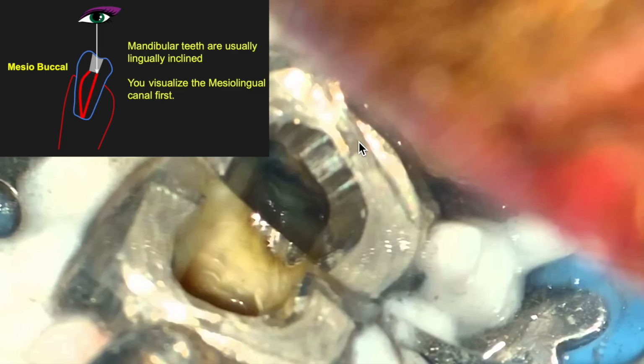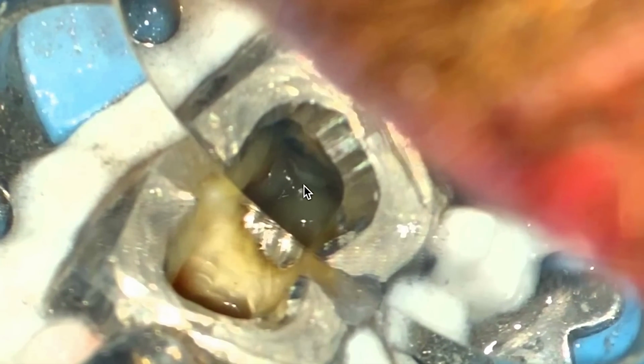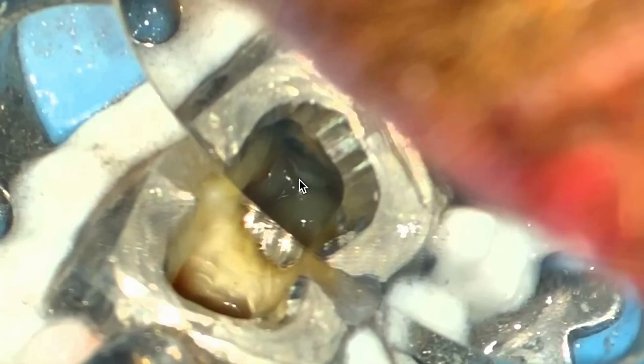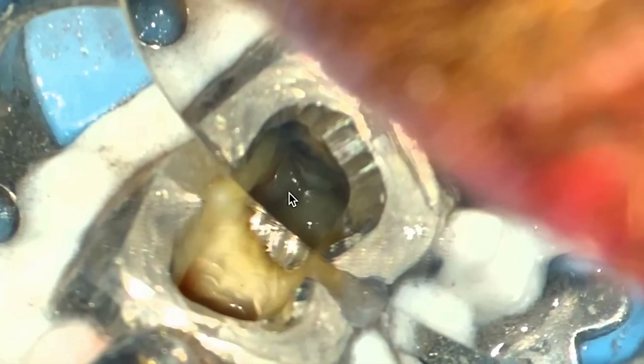It's difficult to access this for a couple of reasons. One, the tooth is lingually inclined, so you're already trying to come underneath that cusp. Two, we've got some secondary and tertiary dentin laid down. So what are we going to do? If you're not familiar with Krasner and Rankow, this is the symmetry piece. You can see here's the middle of the tooth, the developmental grooves. Here's our mesiolingual orifice. And based on just the symmetry law, mesiobuccal should be right here.